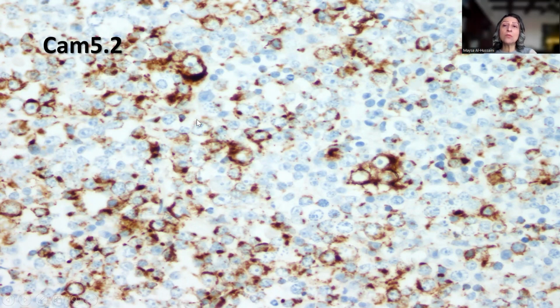What I like sometimes with immunohistochemical stains is that the counterstain with hematoxylin would really highlight some of the features, like the extremely prominent nucleolus that we can see here, sometimes not very evident even on the H&E. So in addition, I always read the positive immunohistochemistry, but I always look for clues from the negative staining. So in the negative staining here, I can see the prominent nucleolus, and then with the positive stain, this strong positivity with dot-like cytoplasmic positivity.